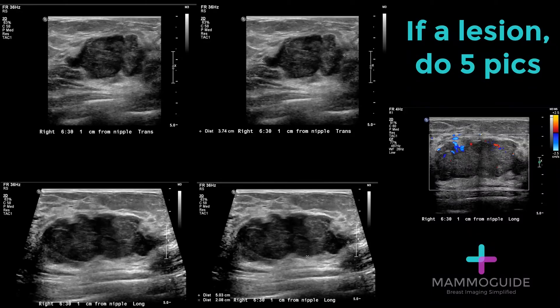If there is a solid mass or any lesion you are going to biopsy, it is required that you do five pictures. If you find a solid mass, it is required that you do four pictures and recommended that you do five pictures to characterize that abnormality.